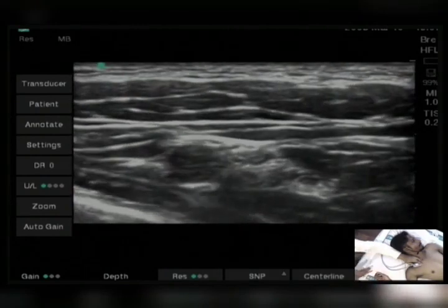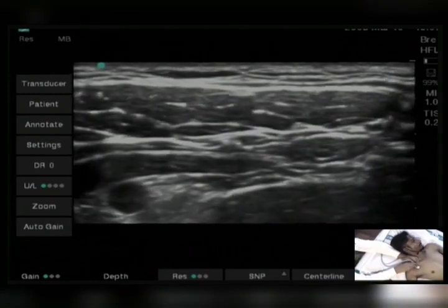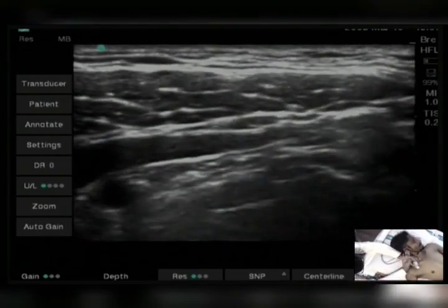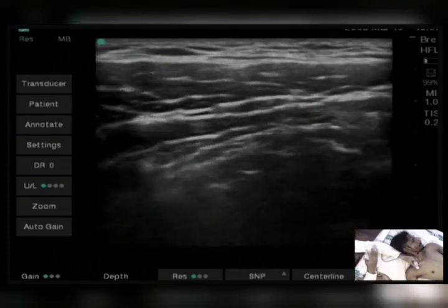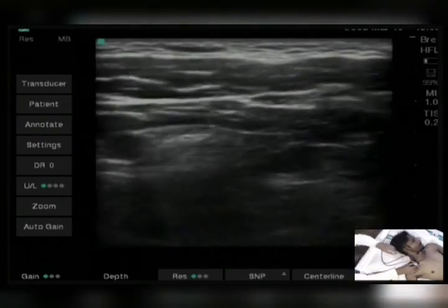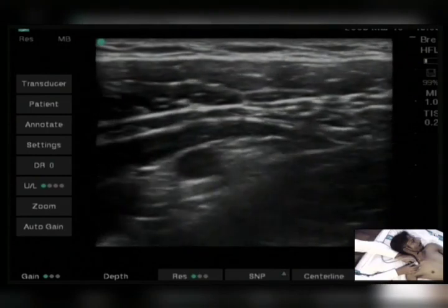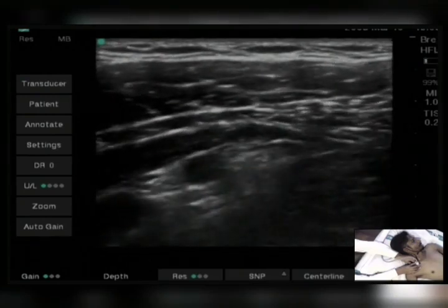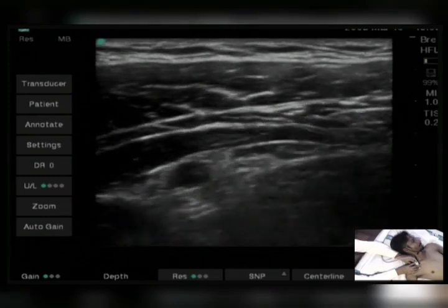So this is costoclavicular. When you go for infraclavicular, the probe has to be put parasagittally inferior to the clavicle, and see, the plexus is coming out in this way. So you have to be almost at 90 degrees to the plexus. Then you can visualize the plexus better. So this is the lateral infraclavicular block. The axillary artery and axillary vein are over here, above it are pec minor and pec major, and the roots are over here, cords are over here, and here also you find the branches of the thoracoacromial.